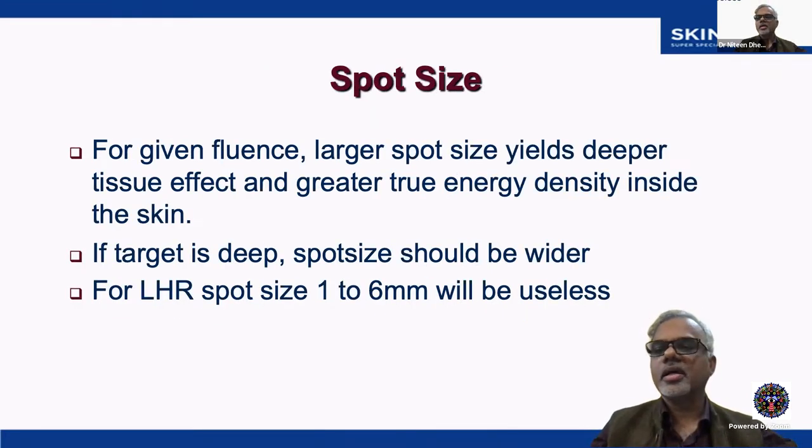So next is spot size. For a given fluence, a larger spot size yields a deeper tissue effect.